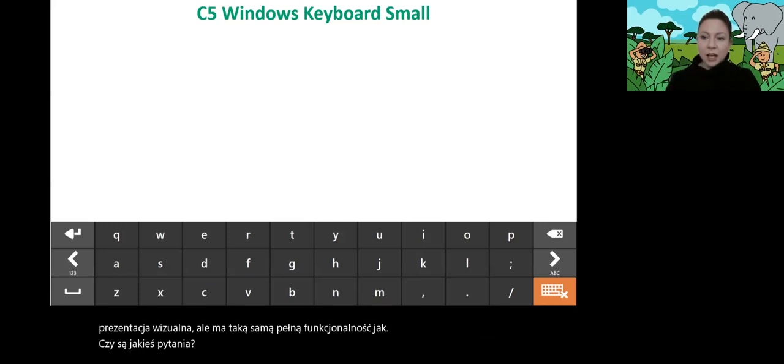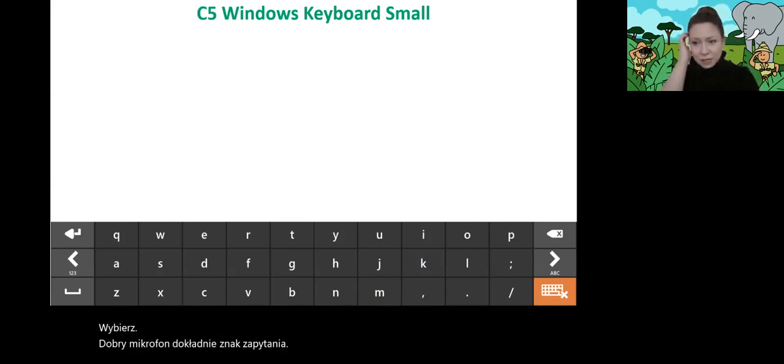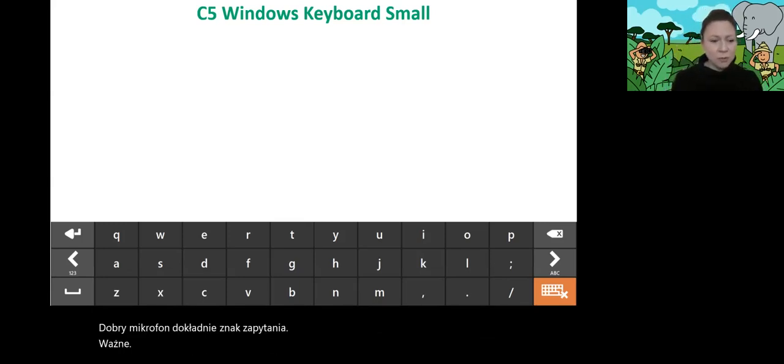Yes, sorry. I will ask it as it was written, but I'm not sure about the meaning. So can you open the button of large keys? Could you clarify, please? I will ask Magda to clarify the question, okay? Because it's an important question, but I would like to have a full understanding of it.